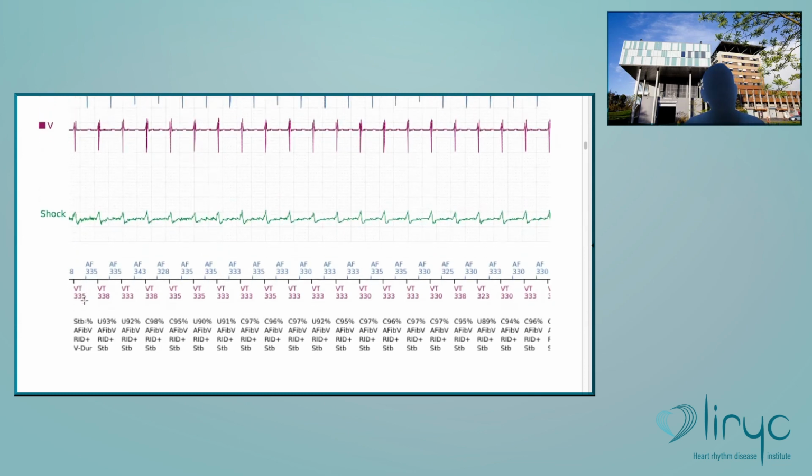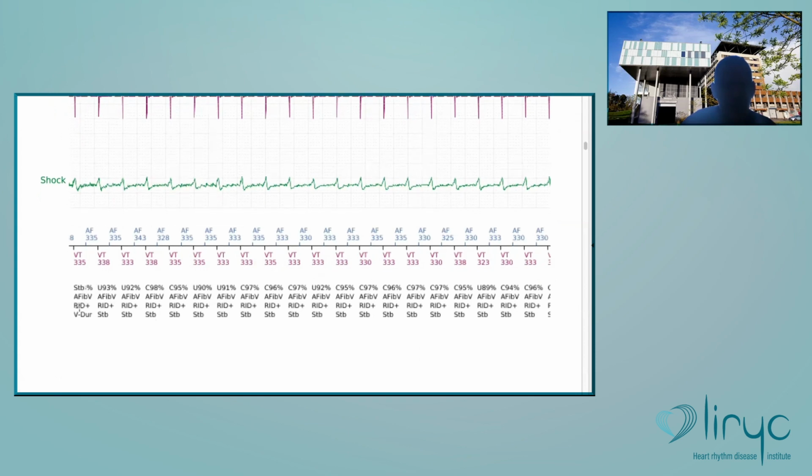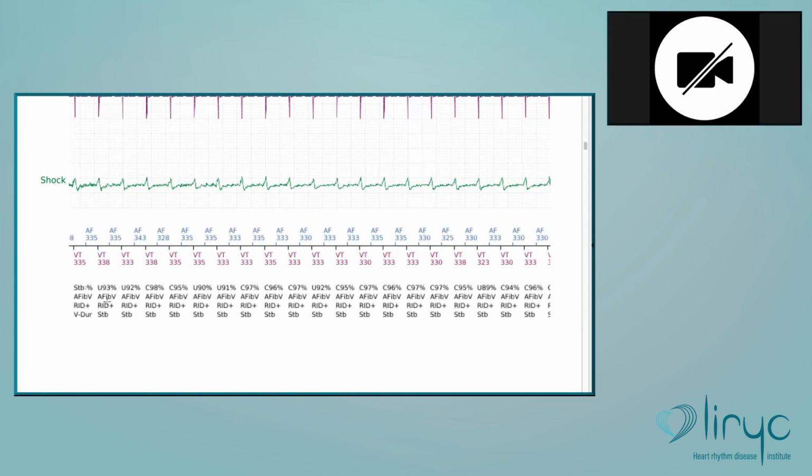So for atrial fibrillation, the nominal value is 170 beats per minute, okay? For atrial fibrillation, it's not a question of stability at the level of the atrium, it's a question of rate only. So the nominal value is 170 beats per minute. And in many patients, it's a bit low. So you will encounter many times a false diagnosis of atrial fibrillation. You see, and then AFib, and initially it's stable. You see? AFib stable.